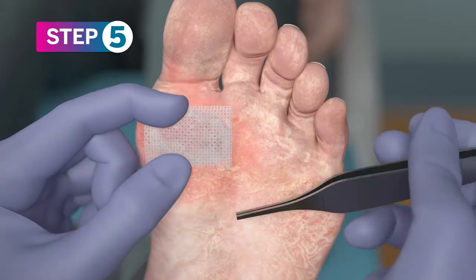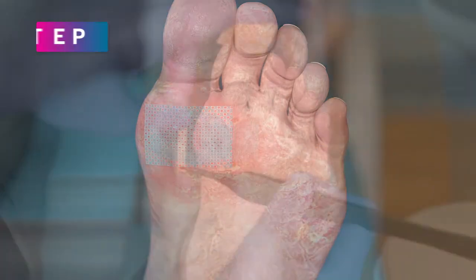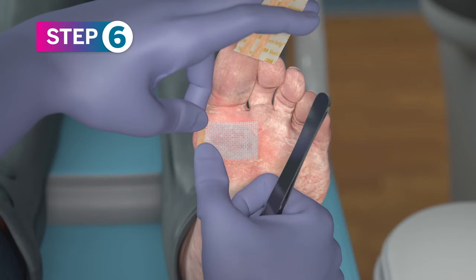Thoroughly cover PurePly AM with a non-adherent. Secure the non-adherent with your preferred fixation method on the outer edges.